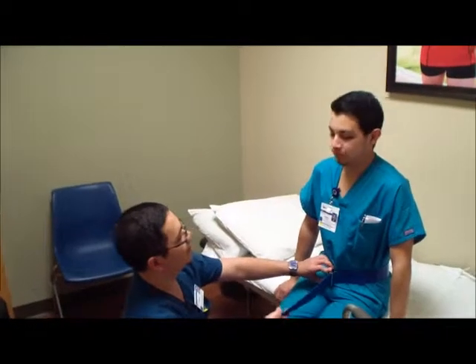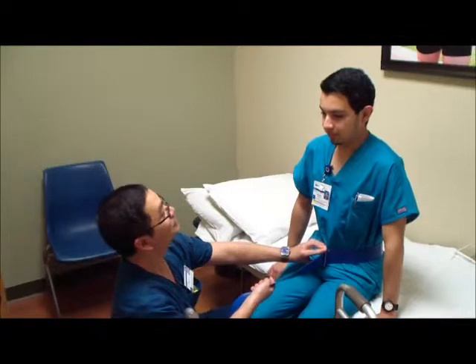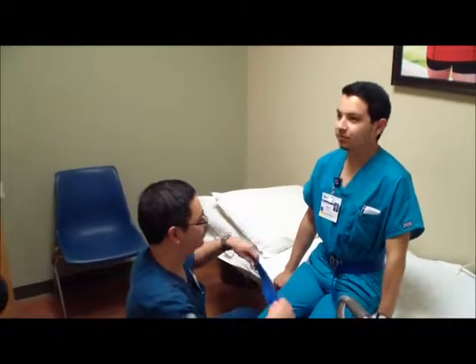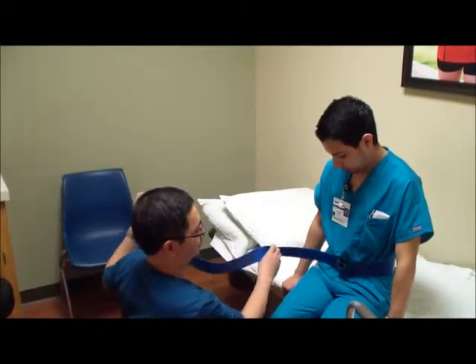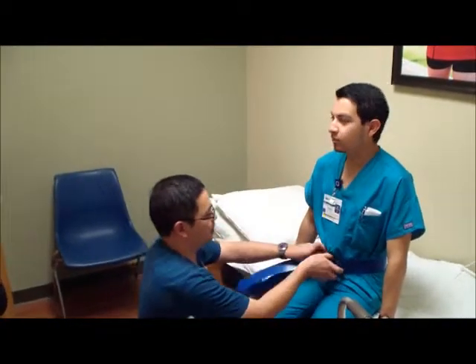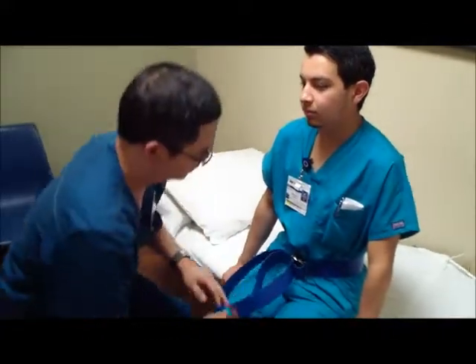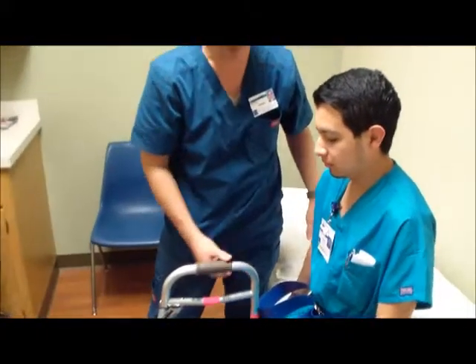Okay. Then I'm going to ask Matthew to breathe deeply and pull on that, that way they'll have the proper adjustment. And so I'm just going to tuck my belt here, okay? And I'm going to bring the walker closer, okay?